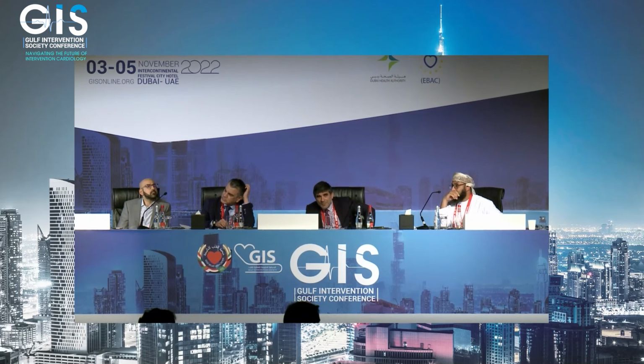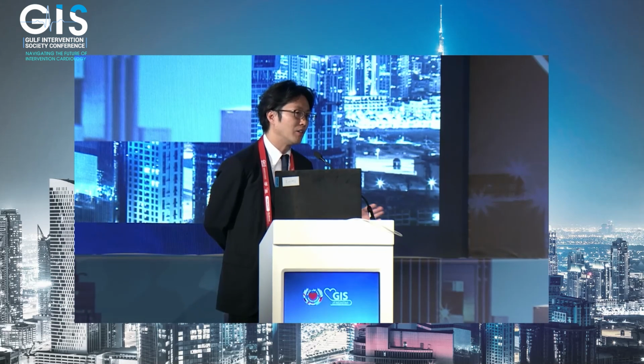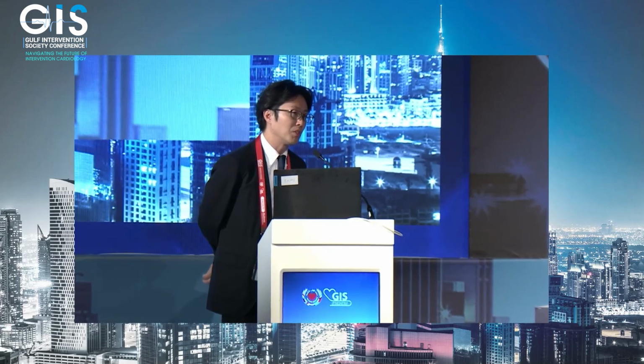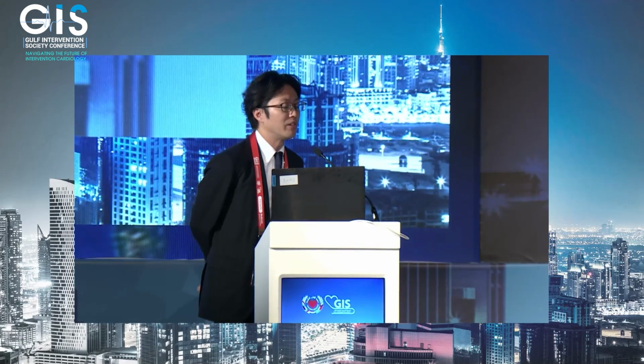Thank you very much. It was an amazing talk. My question is, in terms of your 3D OCT technique, would you do an OCT run every time you recross in the bifurcation PCI? Yes, if the patient has good renal function, we'd like to do bifurcation PCI with OCT guidance, especially in the left main.